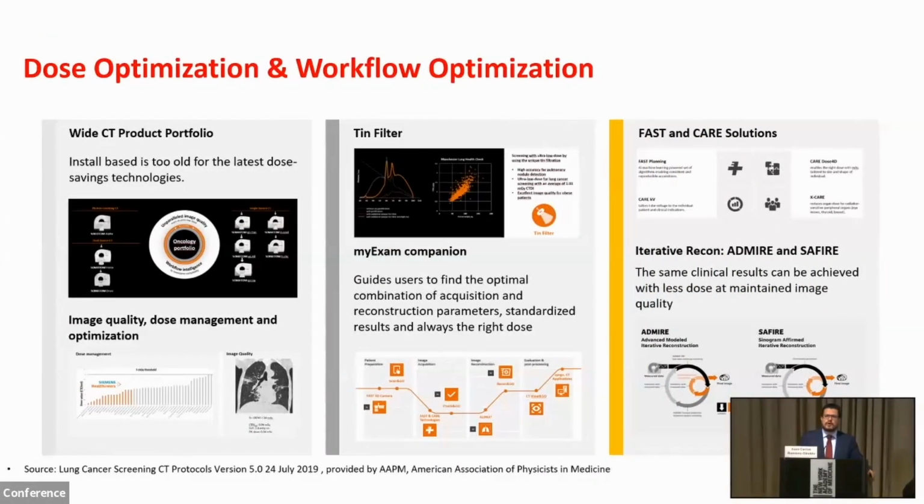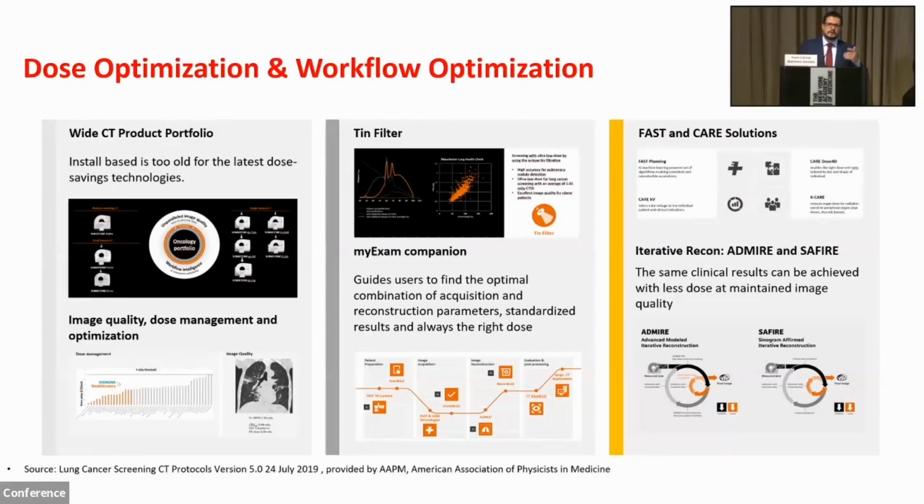And you know, all manufacturers will have different opportunities to provide you with solutions, in the scanners I mentioned, different technologies to help you reduce the dose and maybe to make the workflow a little easier for your technologists, and automating some of the results that you get routinely in the practice.